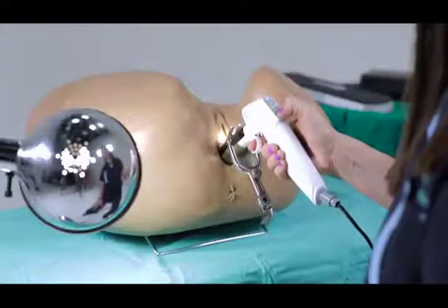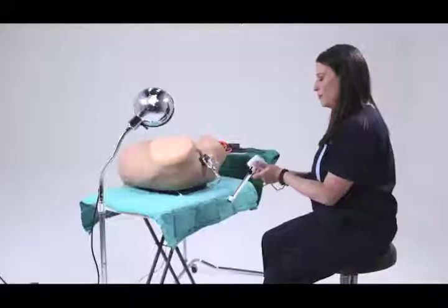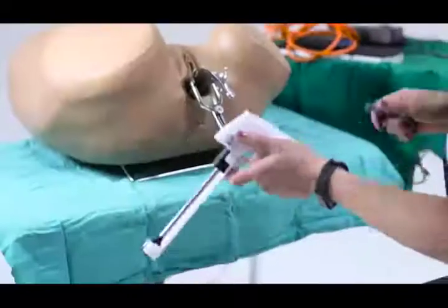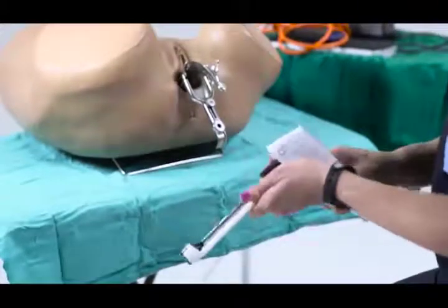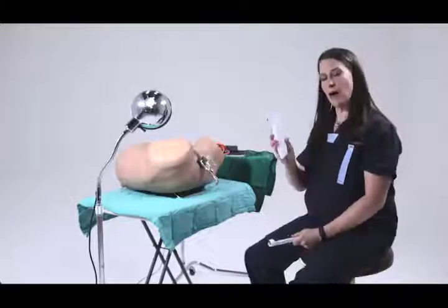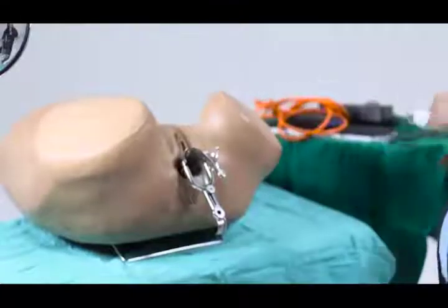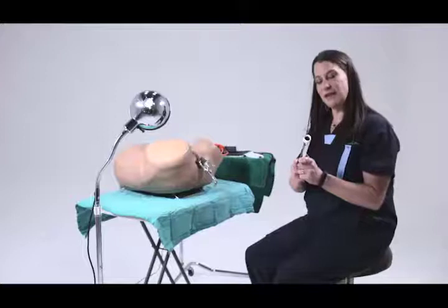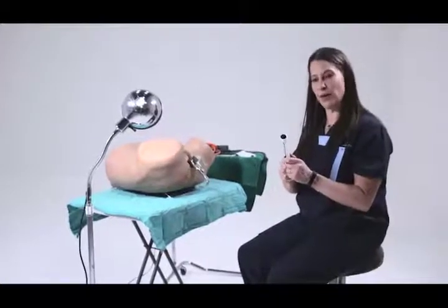When you're ready to stop treating your patient, you can turn it off and then the device gets disconnected from electricity. This part has not come into contact with body fluids, so this part can be wiped off with alcohol. These parts should be disinfected using high-level disinfection as recommended by the WHO.